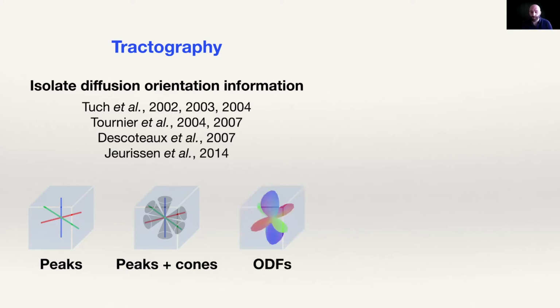The last one is orientation distribution functions, ODFs, which are literally a probability distribution of how orientations are represented in that voxel. That is literally what they are. And this one gives a larger picture of what's going on. So you can see that maybe the vertical fiber has some more uncertainty in some direction. It could happen because biology is very complex compared to the objects I'm showing here. So anything is kind of open bar at that point.